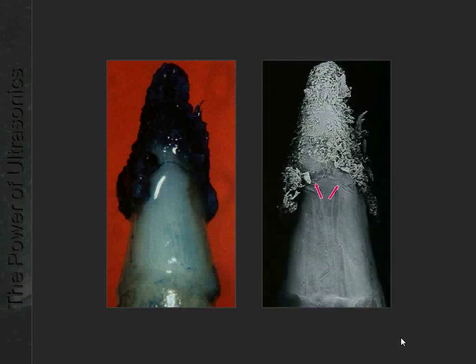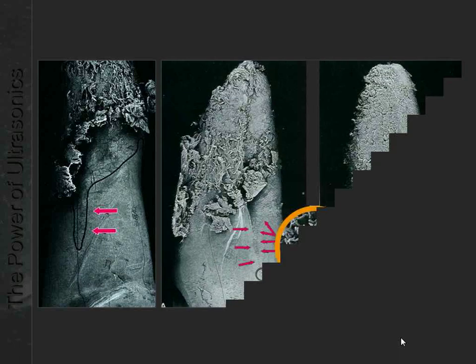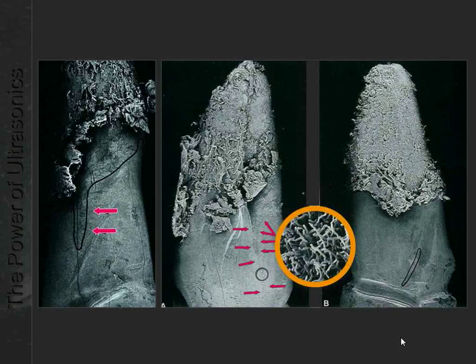pocket was clean. Well, the tooth is extracted here. What you see is the tissue, which has been colored. This is a scanning electron microscope picture of the same tooth, and you see that at the bottom there's still calculus or biofilm present. These are other pictures from the same study. This is where the palatal goes to the proximal, a difficult surface to reach because you need to work around the corner. There is some biofilm left also here, and here are the bacteria waving at you and telling you that they're still present.